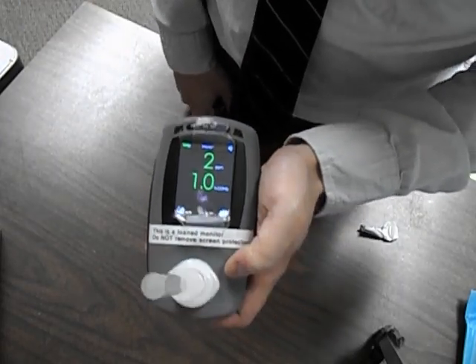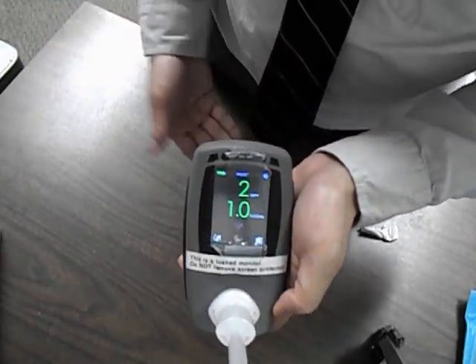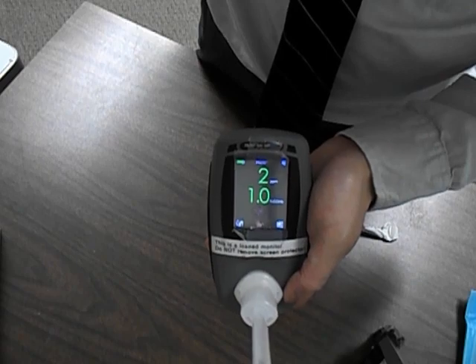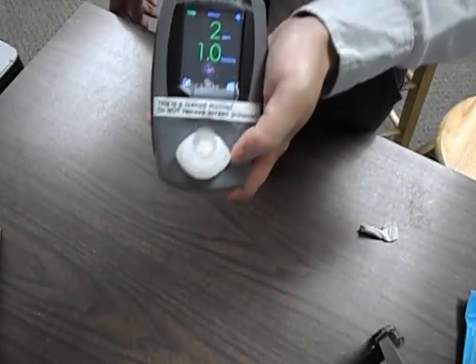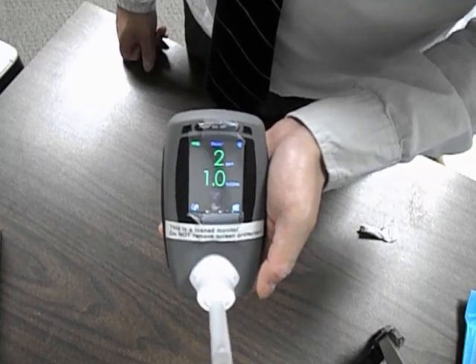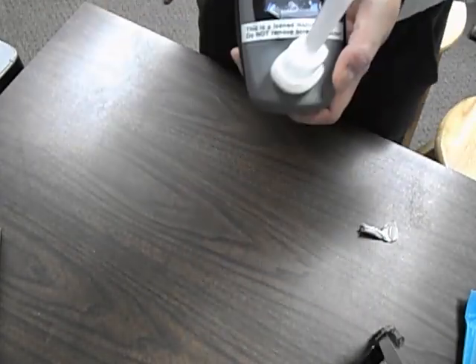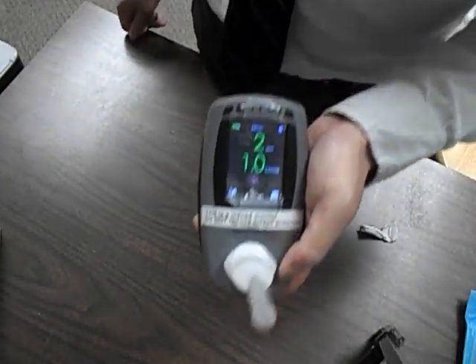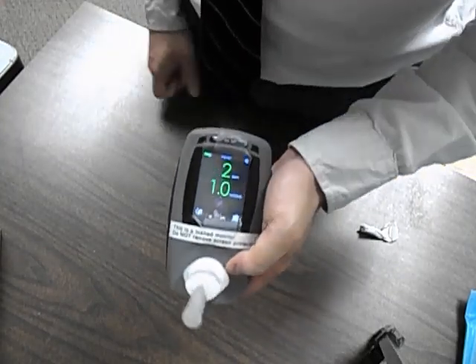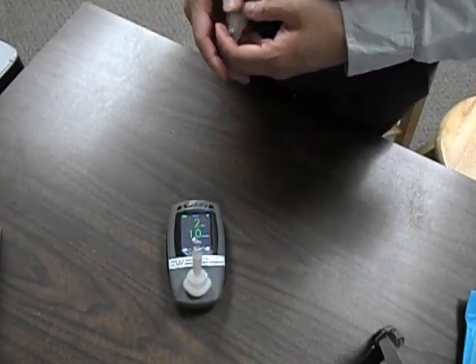The concentration is what we focus on. Ideally, for a non-smoker or former smoker, it should be under seven. No one ever gets a zero — most people get between a one and a three because there's carbon monoxide in the air from pollution. Carbon monoxide is also present if there's a gas leak, which is why people have detectors in their homes. Anything above seven means they smoked.